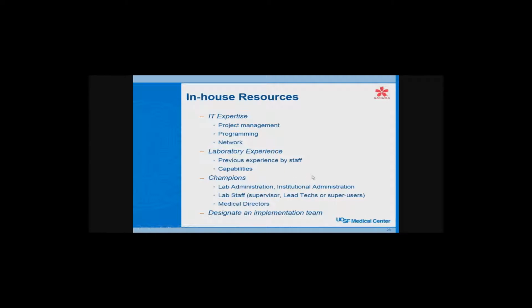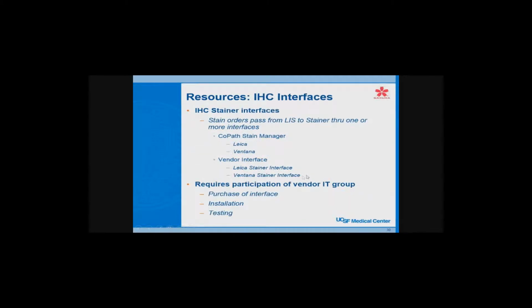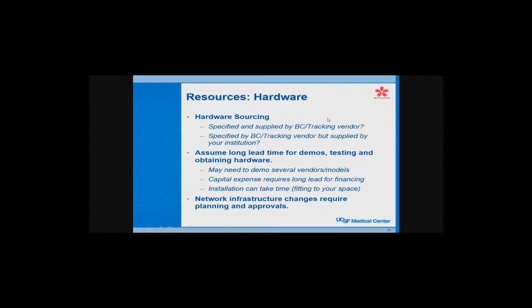Especially your medical directors have to be there, because a lot of the end users are going to be pathologists that have to scan slides to show they got the slides, or order stains in the system in a certain way. Everything has to be done in the system. It can't be all just word of mouth anymore. And then you have to put your team together and make sure they understand they're working on this for many months, sometimes years.